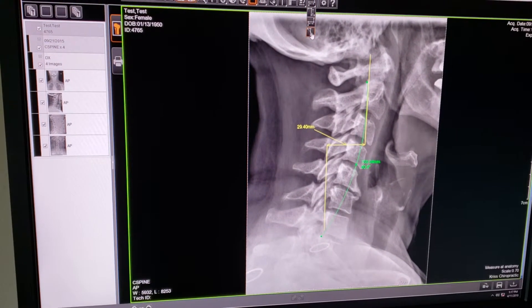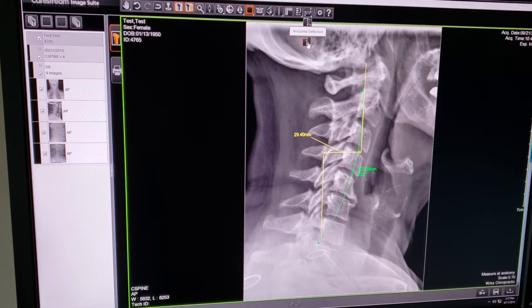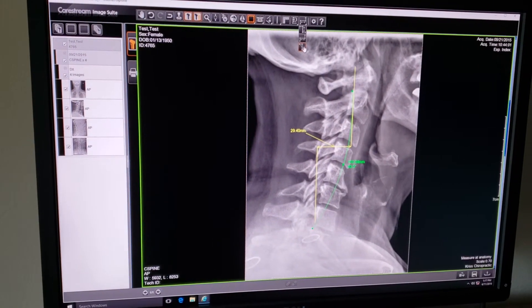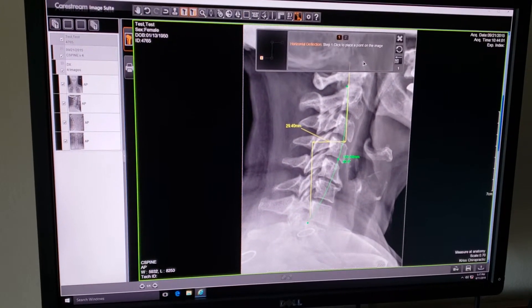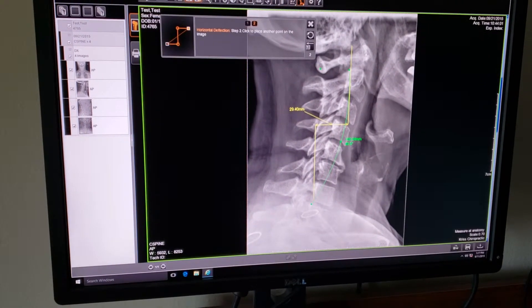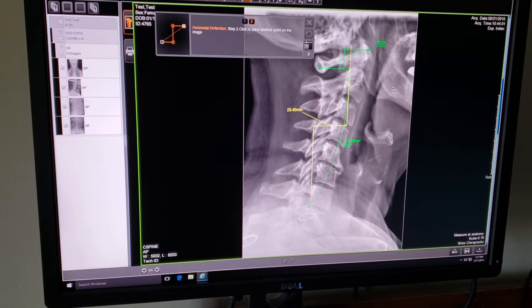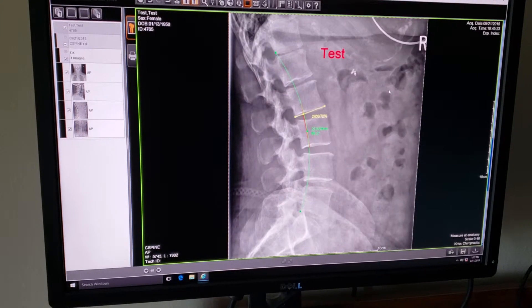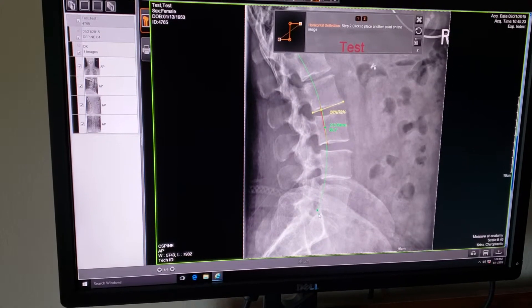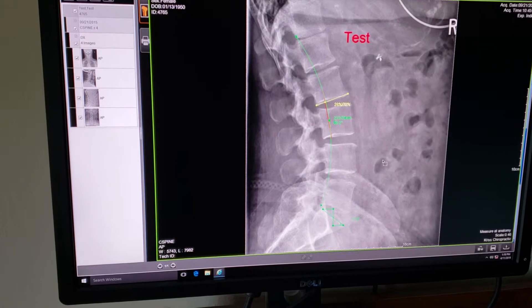The last tool in this group is horizontal deflection, which measures an angle from perfect horizontal. To measure the angle of C1, left click on the first point, left click on the second point — it is telling us that angle is 19.5 degrees. You can also measure the sacral base angle with the exact same tool: left click, left click, left click — 37.8 degrees sacral base angle.